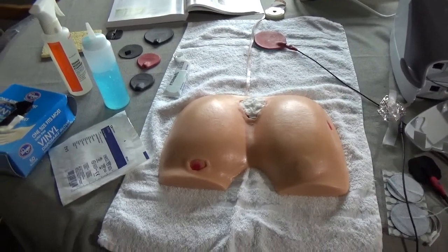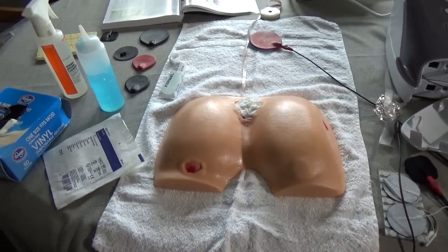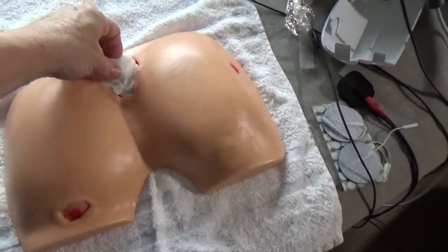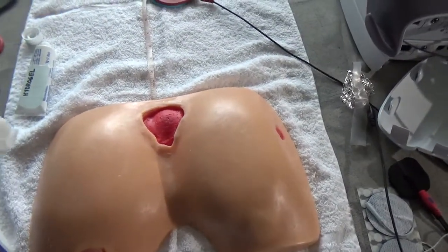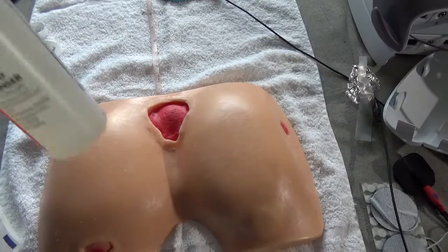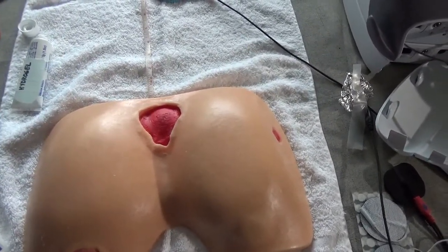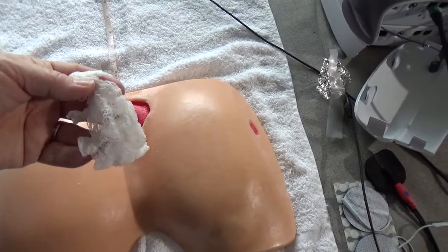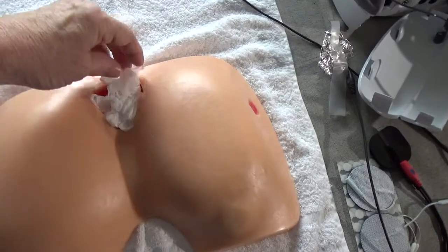Hello, it's Dr. Karen Smith with HPVC — high volt pulse current — and wound care. Here our patient has a sacral ulcer that we're currently treating and the dressing has been removed. It's been cleansed with a wound cleanser or normal saline .9 saline, and there is fresh clean saline on this new gauze, which is packed in very loosely into the wound bed.